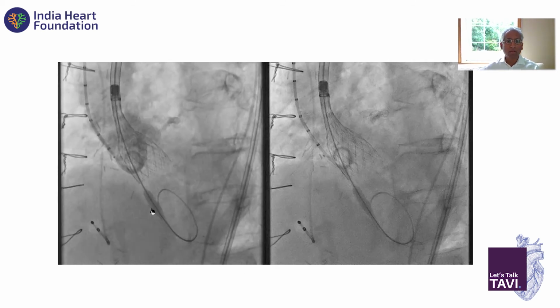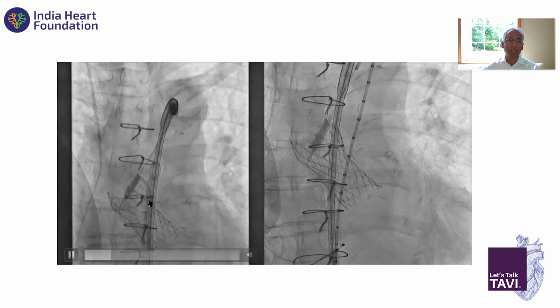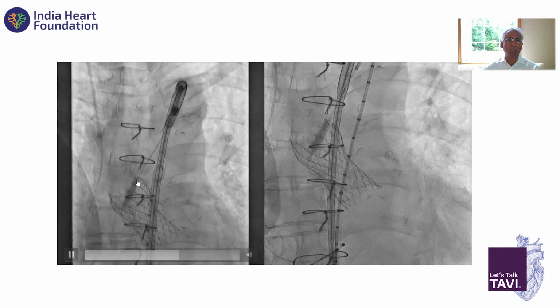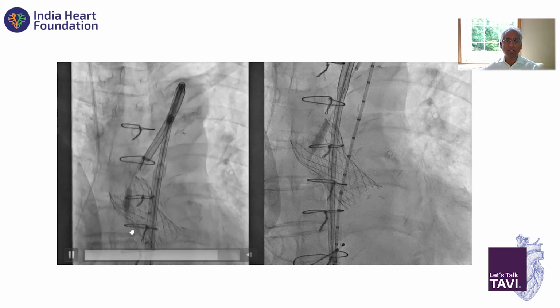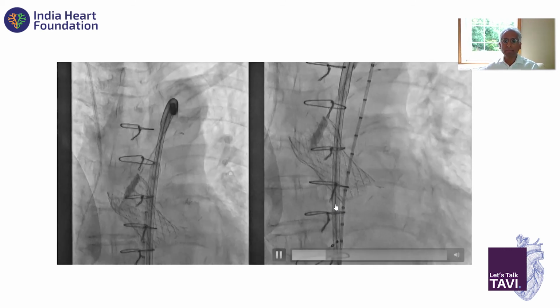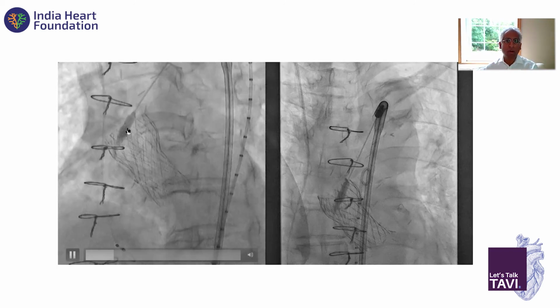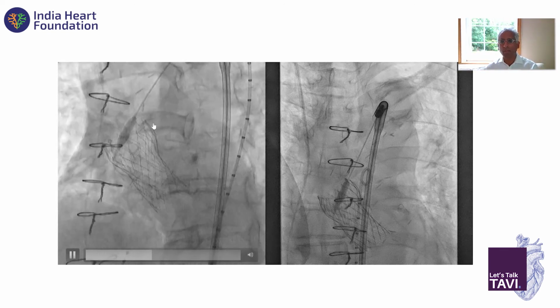Yeah, okay. So on removal of the delivery system, because of the very short ascending aorta and the angulated aorta, it was impossible to get the nose cone out of the outflow portion of the frame. Tried many ways. One is to actually advance the wire in and try to deliver it. It still does not go. So then the other trick you can do now is to use, you can see that, different wires, different angles, it's just getting caught in it. And if you pull this out really quickly, you could have easily pulled this valve out.